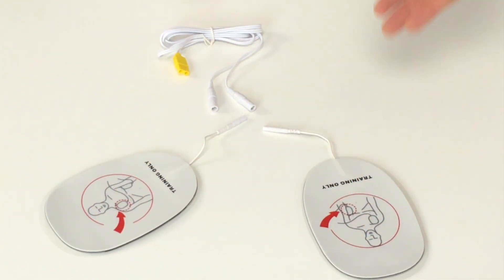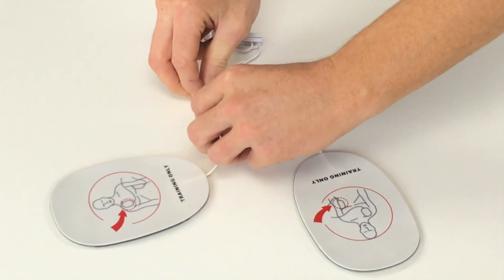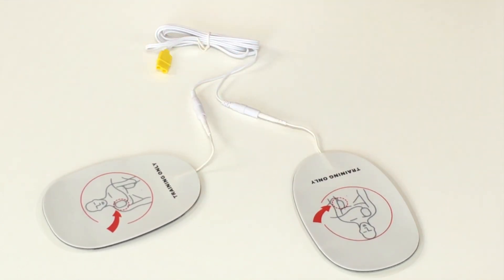When the unit arrives, we connect the pads to the wires and we leave them connected like this until, after many many uses, we eventually need to replace the pads.